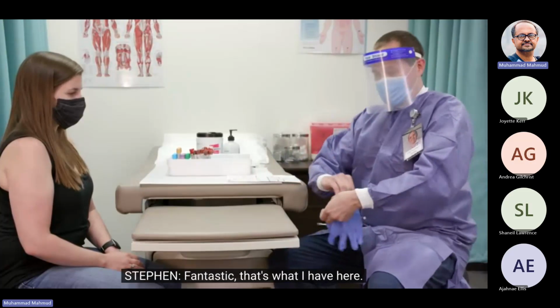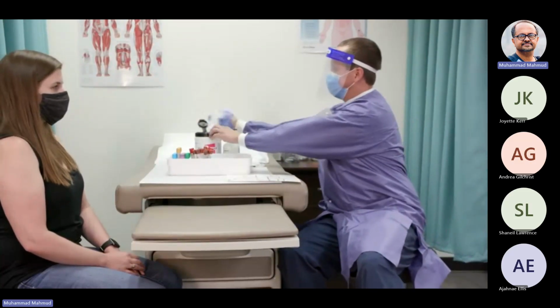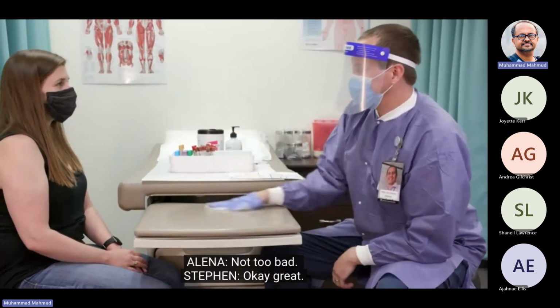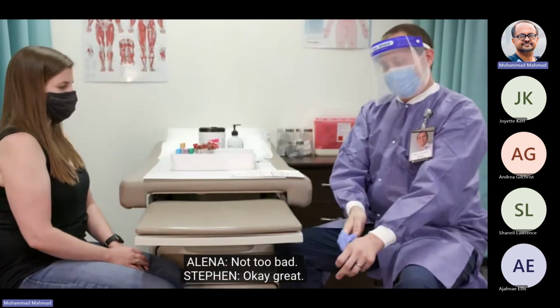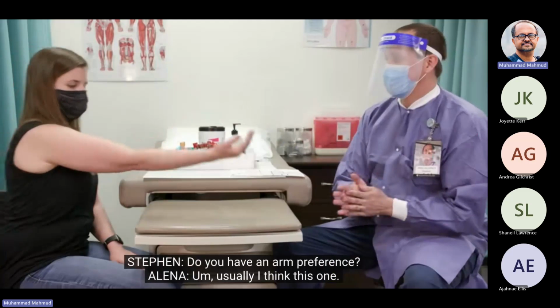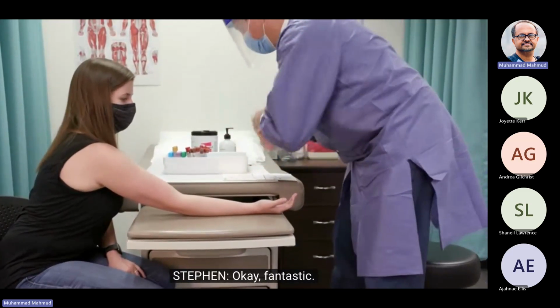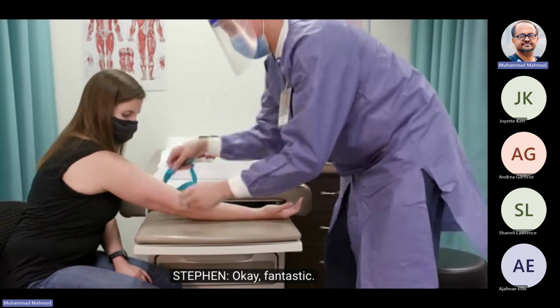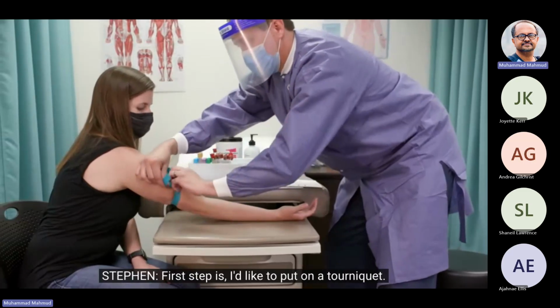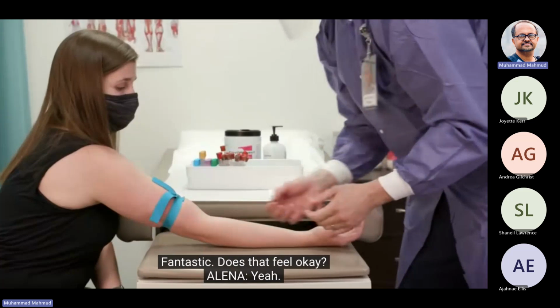I'm going to give your table a little wipe down here. Okay. So how do you generally do with blood draws, Elena? Not too bad. Okay, great. Do you have an arm preference? Usually I think this one. Okay, fantastic. All right. First step is I'd like to put on a tourniquet. Okay. Fantastic. Does that feel okay? Yeah. Okay.